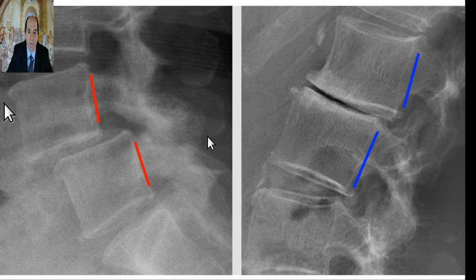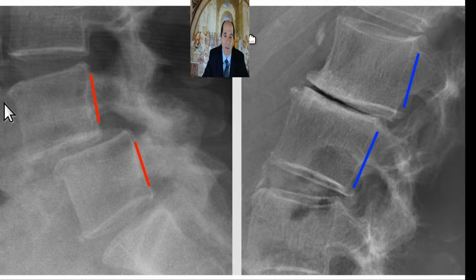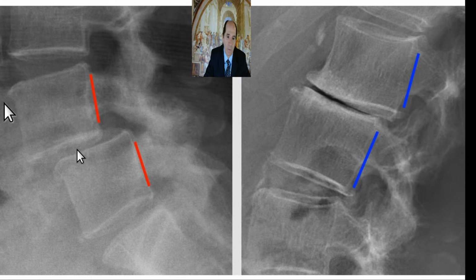Okay, now here are some other findings we often see in the spine. This right here is when there's offset, slippage, you name it, relative to the vertebral body above compared to the one below. So this would be anterolisthesis, slippage anterior, of the posterior vertebral body end plate contour line relative to this one. It's slipped forward. You can also see this disc space is narrow. The disc space should get bigger as they go down. So you would have moderate disc space narrowing with grade 1-2 anterolisthesis.